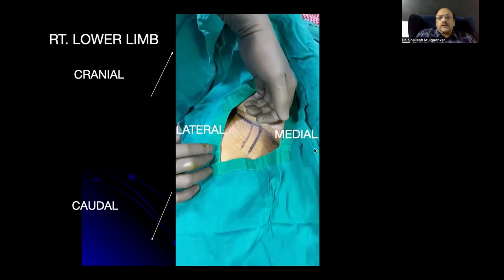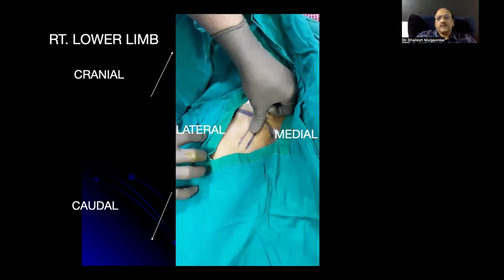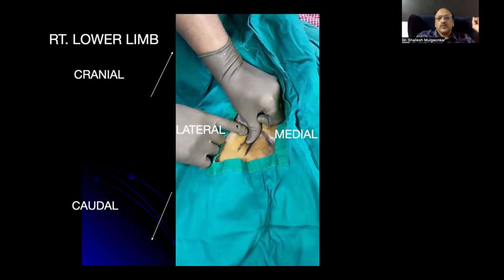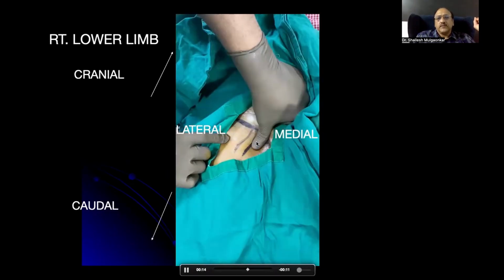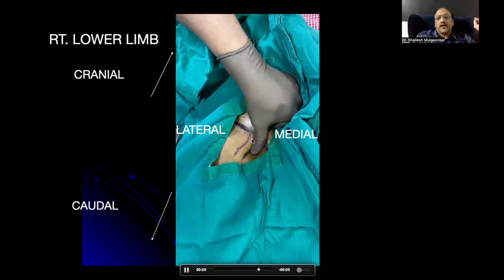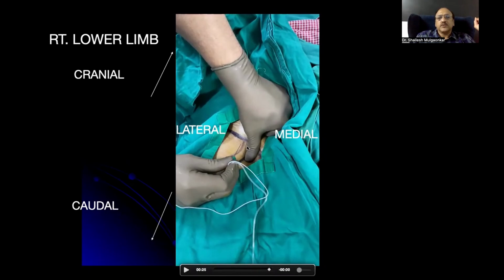So this is the patient. This is the right hip. Head end is on this side. Foot end is on this side. And what I usually do is push the tummy with my fist and then press the thumb so that the nerve becomes much more superficial, and I tilt the thumb so that I don't feel the pulsations here. Suppose my thumb is here, I can still feel the pulsations. Okay. And if I go 1 centimeter lateral to it, I can puncture the artery directly. So I always tilt and confirm there is no sensation on this side of my thumb, no arterial pulsations. Right.